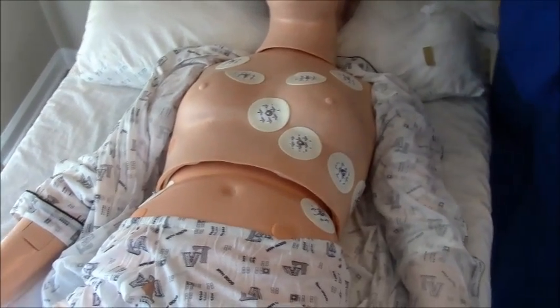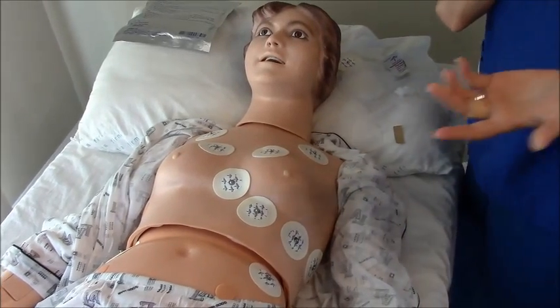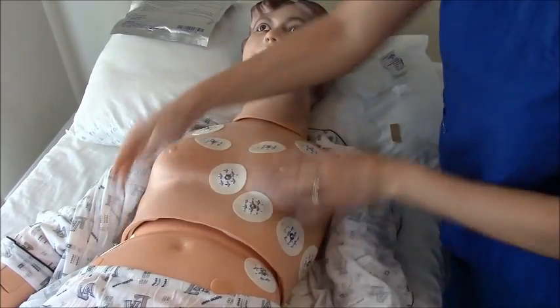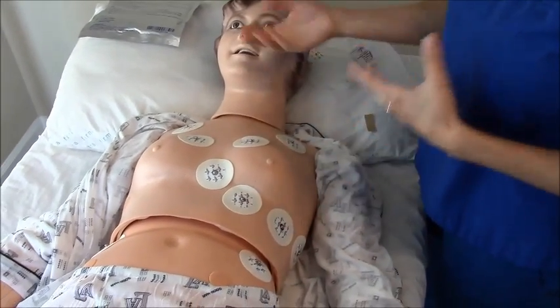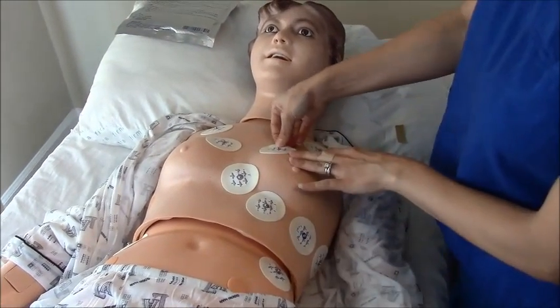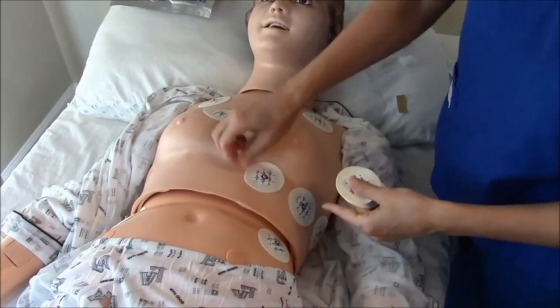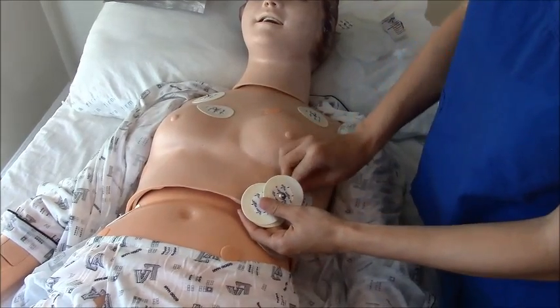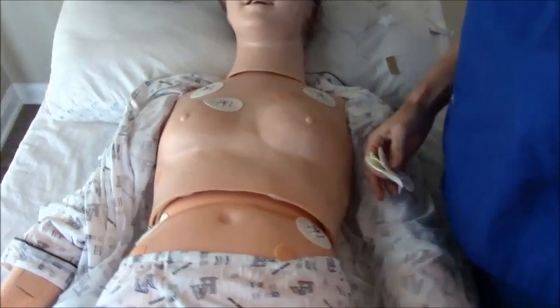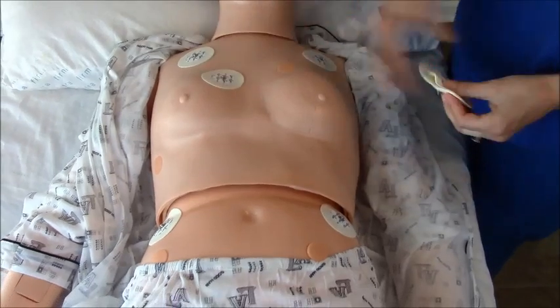If you are doing a telemetry box, normally they use five leads. That's the little box the patient wears in their room so telemetry can monitor them. You have your limb leads on and one chest lead — I like to use V1 or V2. So you would keep V1 and remove the other precordial stickers. That's what a basic telemetry box setup looks like: arm leads, leg leads, and V1.